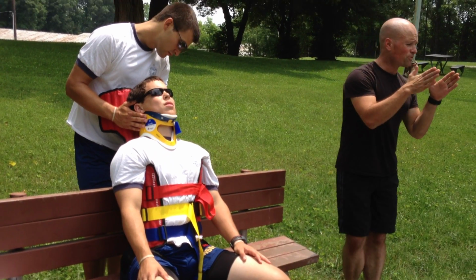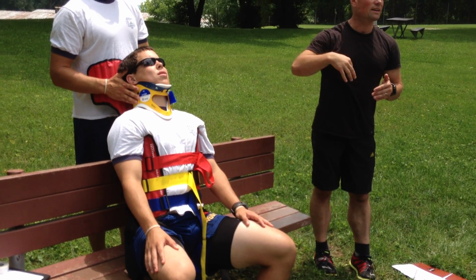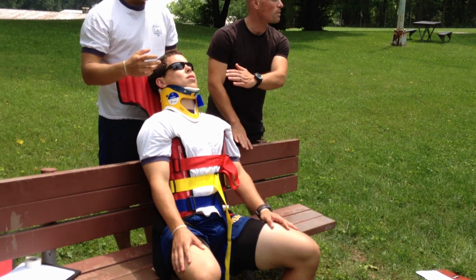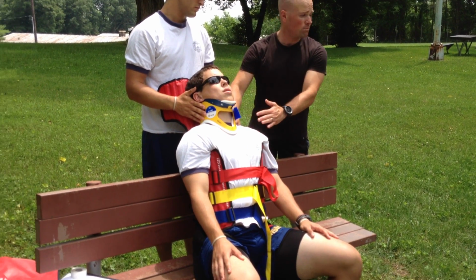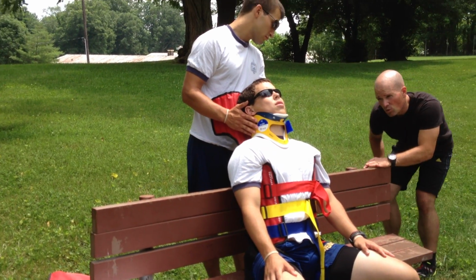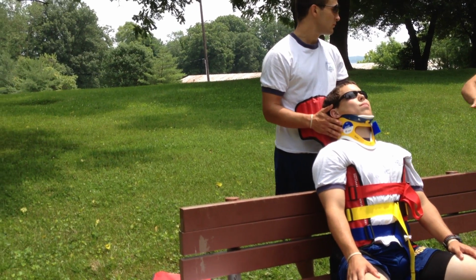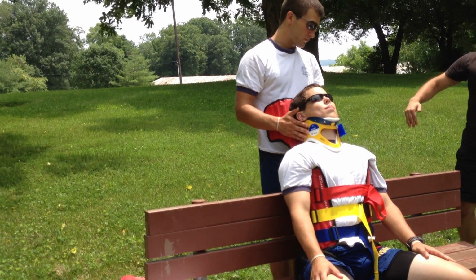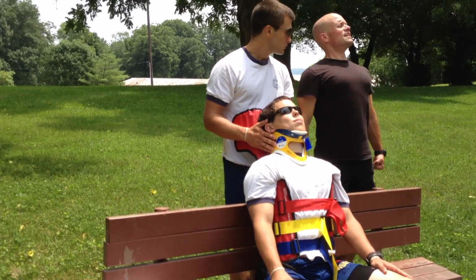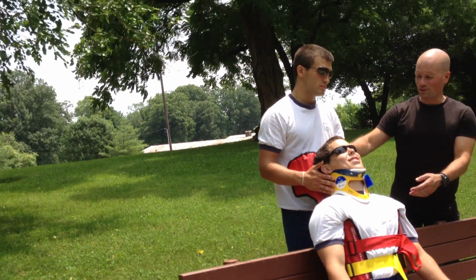But the device is going to be a full 6 inches from my grandmother's head. If that's the case, we can add a little padding in there. But don't add padding if it's not truly necessary, because a neutral spine is the goal. And if the spine can be neutral, we'd like it to be neutral. So I'm seeing here that with little to no padding, I like this picture, so I'm not going to add any extra padding on this patient. I don't think I need to fill this gap. Right? He looks a little like he's standing at attention, but I can live with that. In fact, you all are used to standing at attention, so that's what this will feel like.